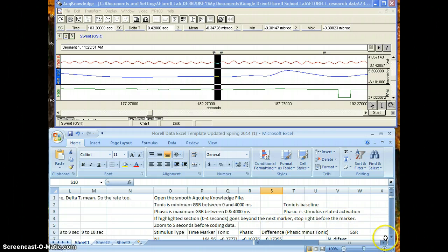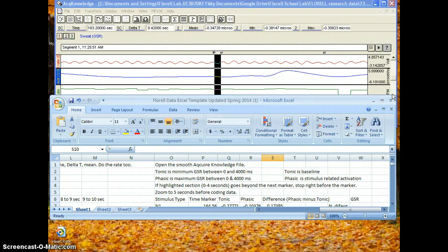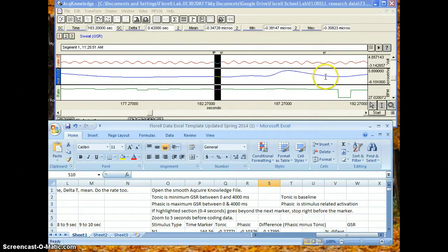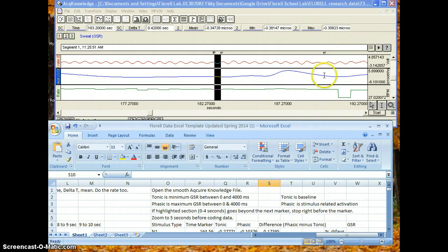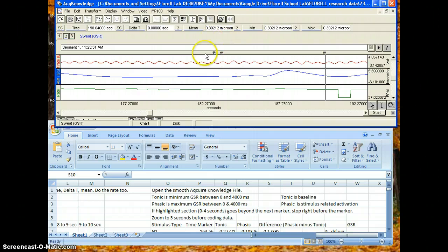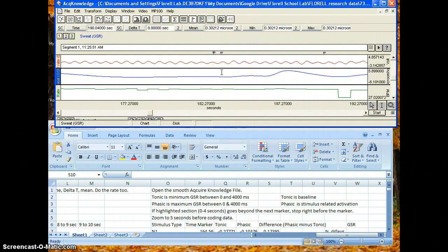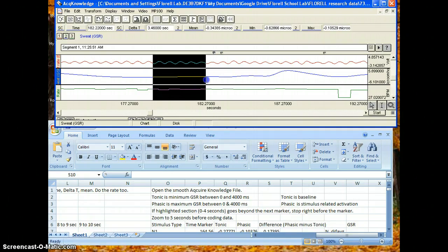So that is how you analyze GSR. But once again, just keep in mind that if the GSR is not flat at your time marker, like this one is pretty, I mean I wouldn't analyze this one, but if it's not flat you don't analyze it. If your time markers overlap your four second mark, then you just highlight up to the next time marker. If you have really good flat GSR, you highlight up to four seconds, and that looks like this.